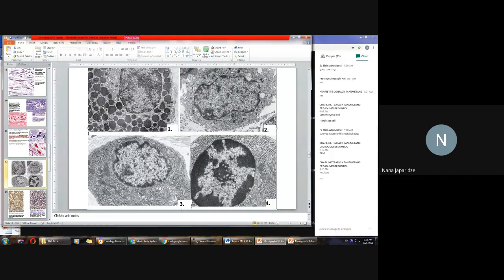So look, please. Usually, nucleolus is not so dark stained because of prevalence of heterochromatin. No. So nucleolus contains a lot of RNA, which is in a very active state. I mean, the main function of nucleolus is ribosome production.